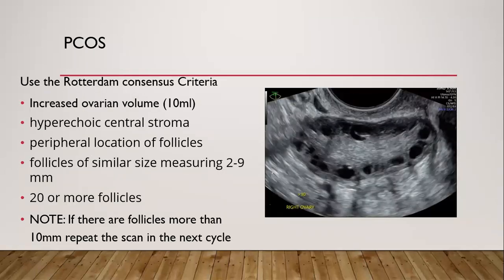So typical to ovaries, we can check for PCOS. This is polycystic ovarian syndrome. I think there was a case in the group some months ago for PCOS, and there were discussions between PCOS and cystic ovaries.